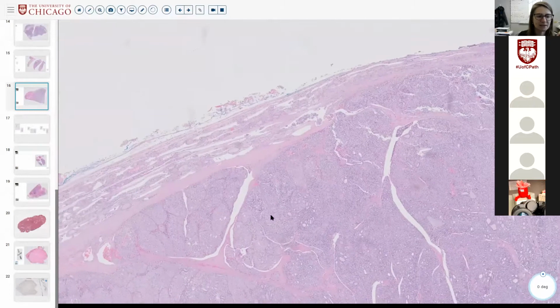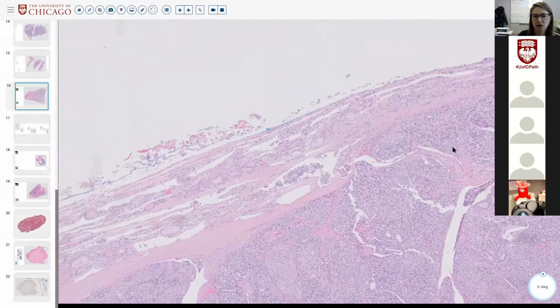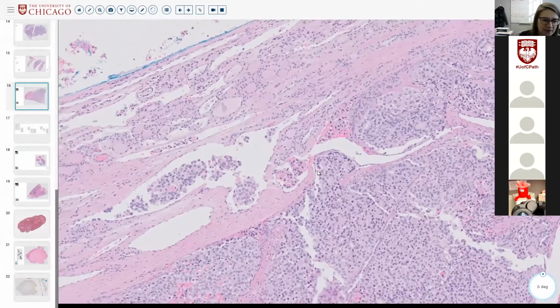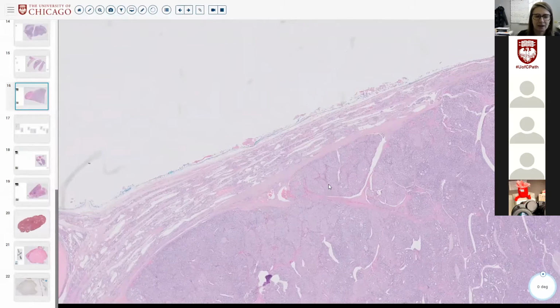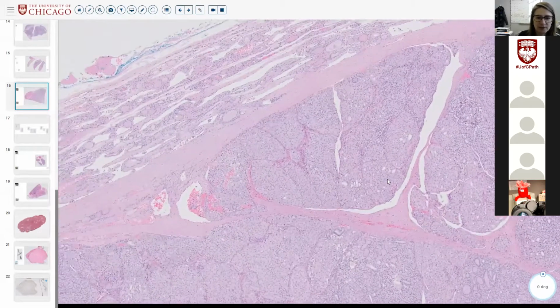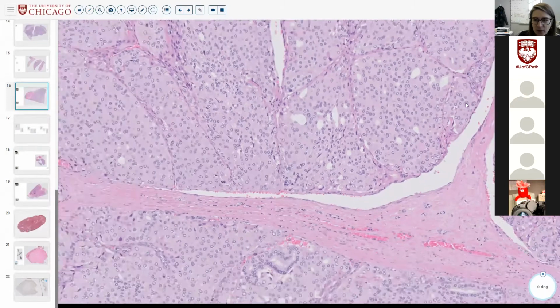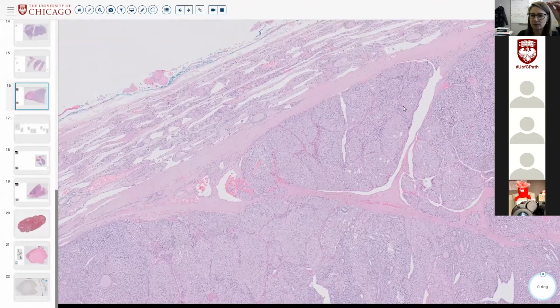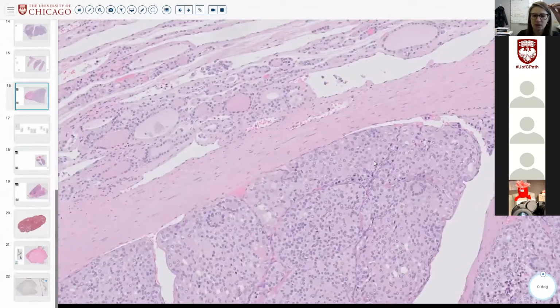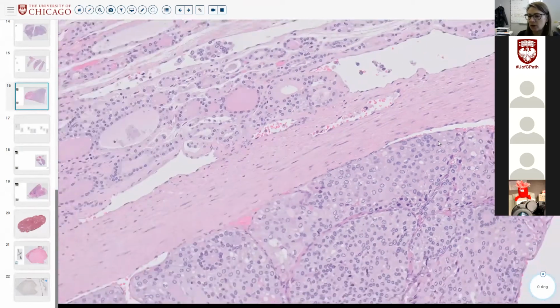But basically, you have to have an invasive neoplasm. And for the sake of argument, let's just call this invasion, even though maybe it's not perfect invasion on this slide. Overall, this tumor was invasive. And in fact, maybe this is actually a focus of angioinvasion, where this kind of triangular shaped plug is in a vessel lined by endothelium.